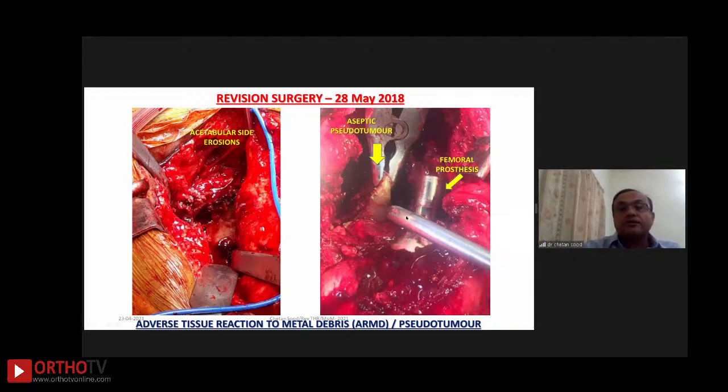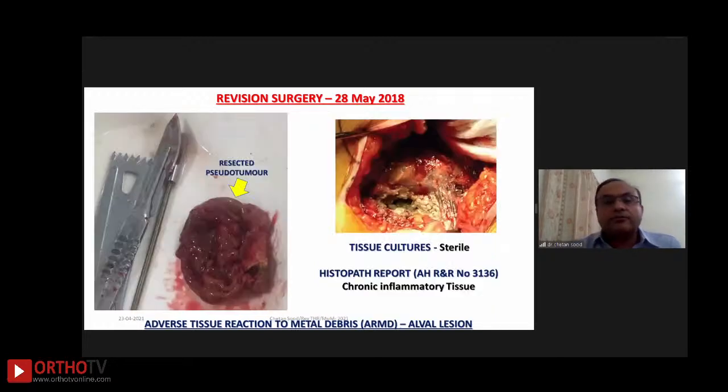If you can see this rubbery kind of material, it is all rubbery material, which is going deep into the groin area, around the acetabulum and also into the sciatic area. So that was eventually pulled out slowly. And we had good indication from that MRI, a nice MRI was done. The stem doesn't look very good, but I'll show you a better photograph of this.